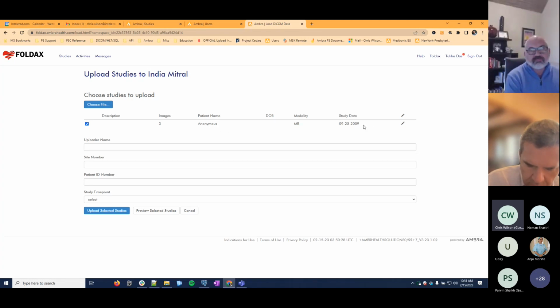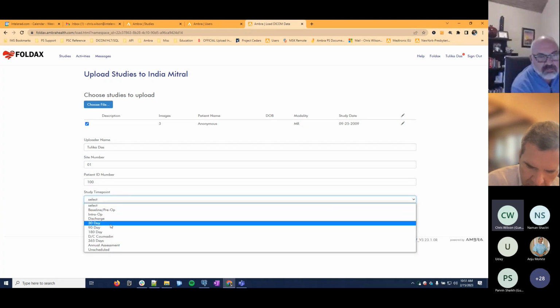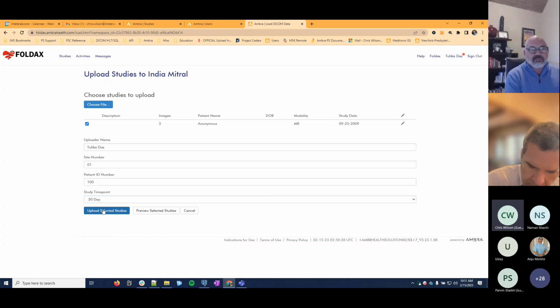Now, obviously, this is going to look a little different for you. We have a few questions that we need you to fill out prior to uploading. These may look different by the time the actual study starts, but ultimately anything that's on here needs to be recorded. In this case, I'll put the user that we're logged in as. Again, site number, patient ID, this might change. Ultimately, I'm just going to put site 1, patient ID 100, and then the time point being where it's at in the process currently. We'll mark it here as just our 30-day for the moment.